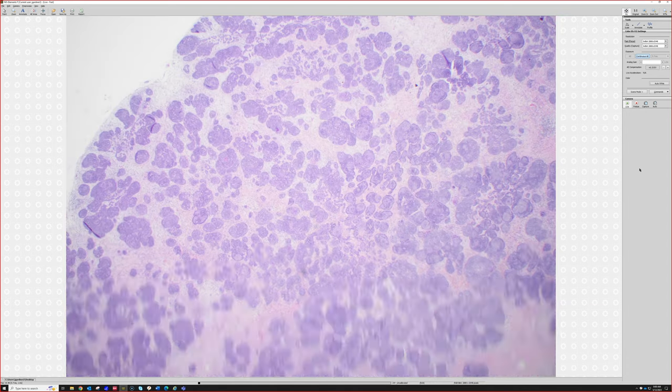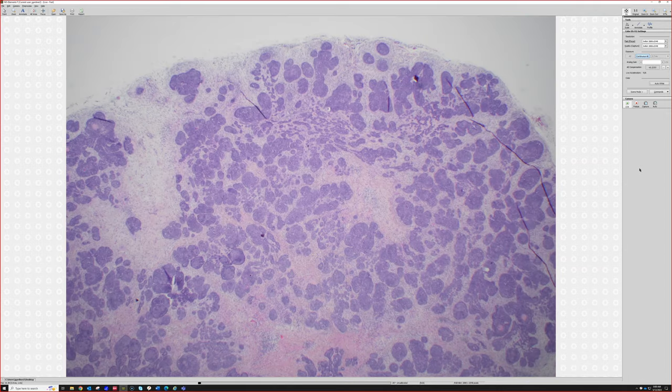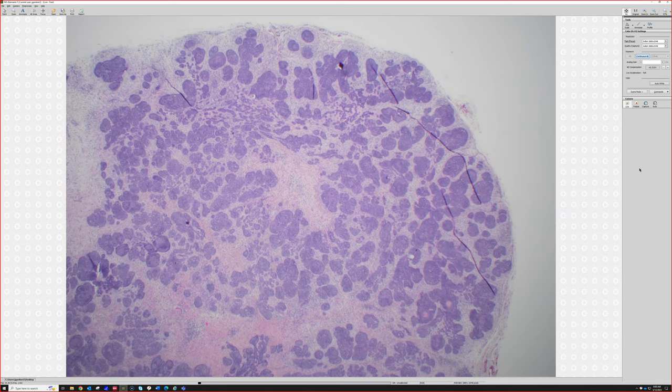It's a trichoblastoma. Oh, yeah, well done. 2X, and even before I had the lighting right there, it's right now. Yes, trichoblastoma. How did you know, Barath? Oh, just the basilar cells, and it just has the typical pattern. Yeah, it just has a look, doesn't it? Yeah. It's got a look.